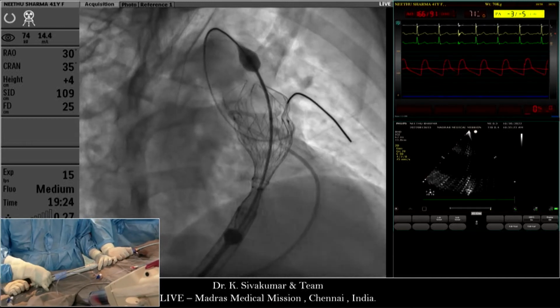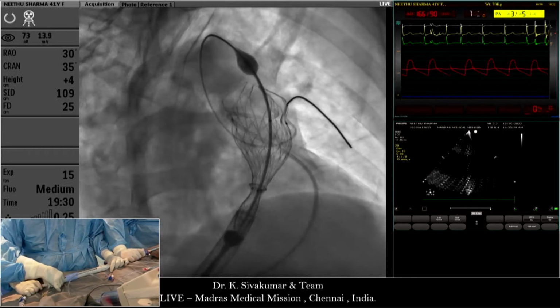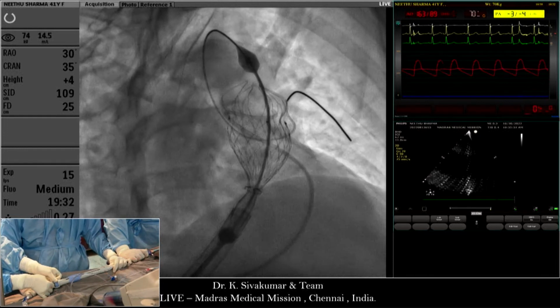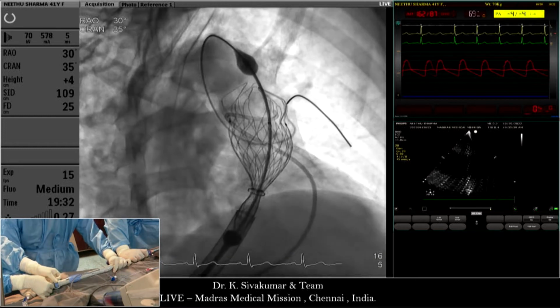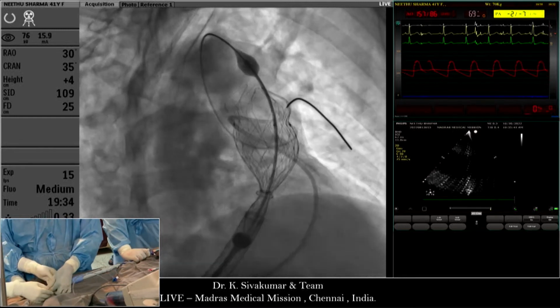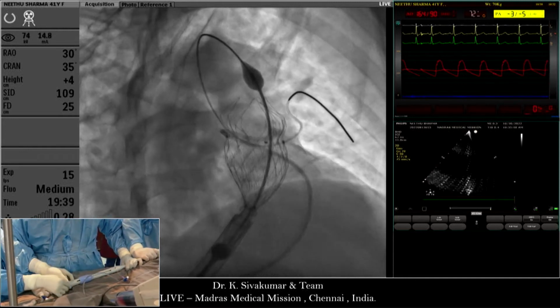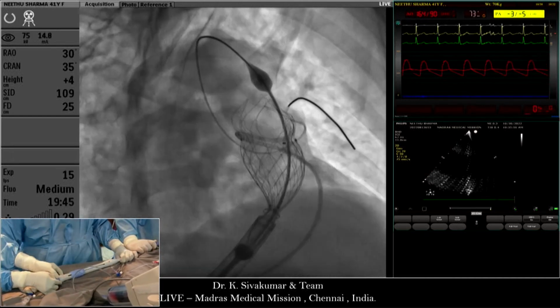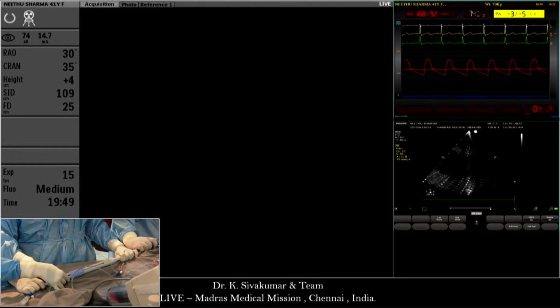Open up to the distal gold marker. Yeah, but probably not go beyond this before you open more. Hold it there. So ready for an angiogram? Please. Yes, I will. I'm now trying to push the guide wire. I think it will fall back. Let me open the valve a bit more, and let me see one more angiogram.